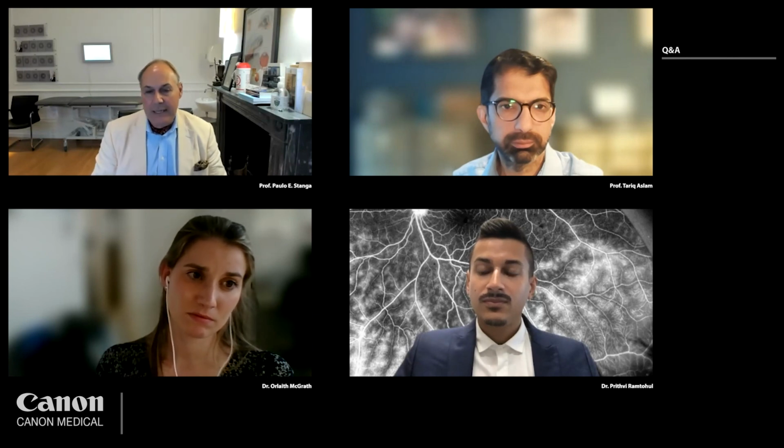Perhaps I'm privileged because I don't do 70 patient clinics for obvious reasons. But we do all our research here in-house at the Retina clinic on Harley Street, and every patient undergoes wide field OCT imaging. Everybody undergoes indirect ophthalmoscopy with 360-degree scleral indentation.